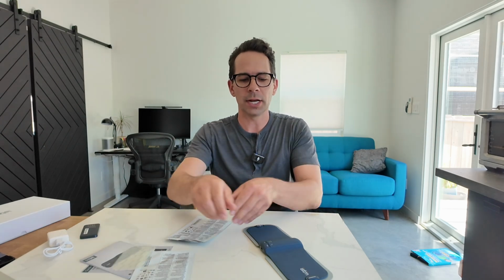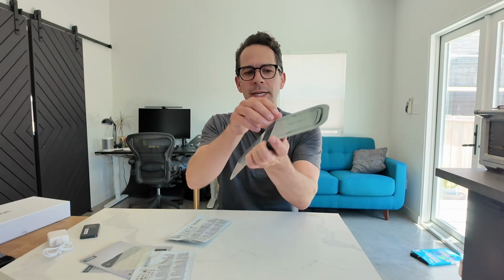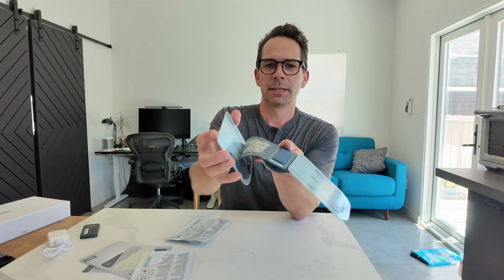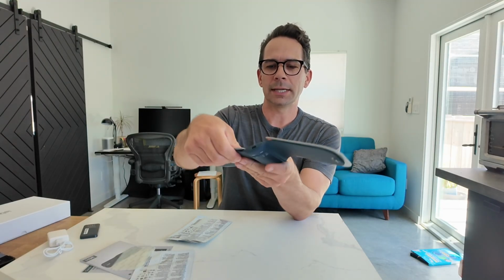Now, these are reusable. They say up to 6 times, but depending on how clean your skin is, you can reuse these. And then when you are not using the device, you put it on these little parking pads that keep those pads clean.